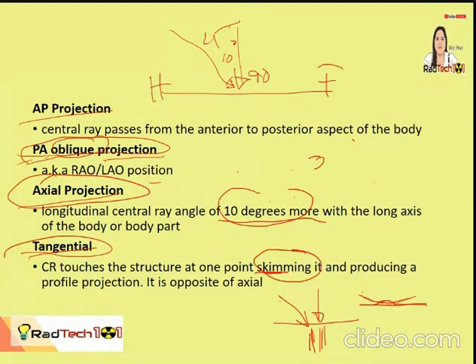It is the opposite of axial. Kay axial, from here, it will pass through sa other side. This is axial. Tangential will just skim siya.